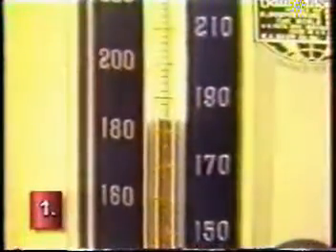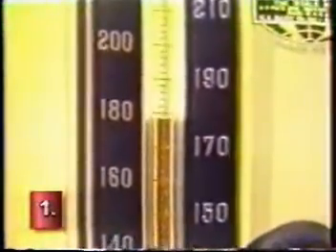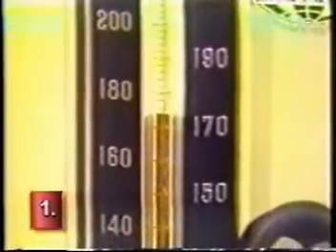Record the systolic and diastolic measure for each sequence. At the end of the test, the answers will be provided for the benefit of those of you who view this tape without an instructor.